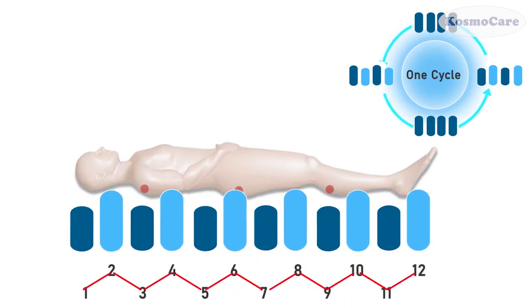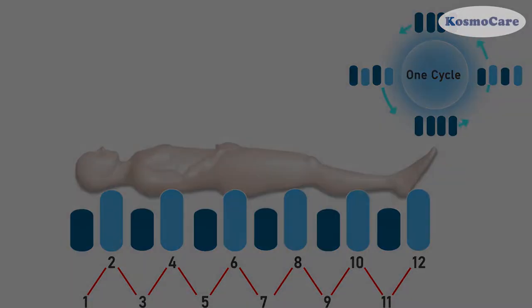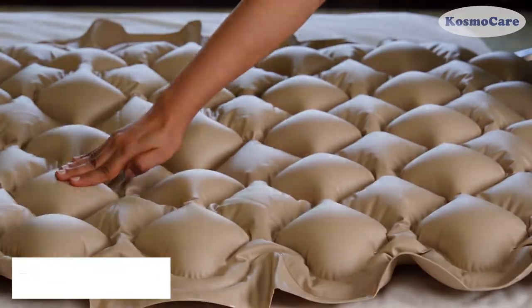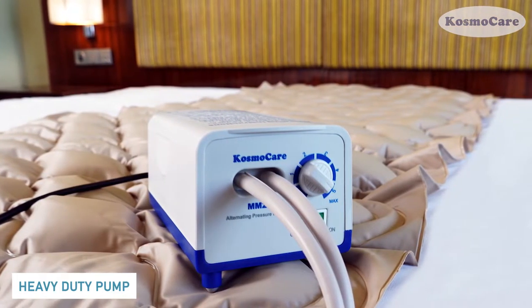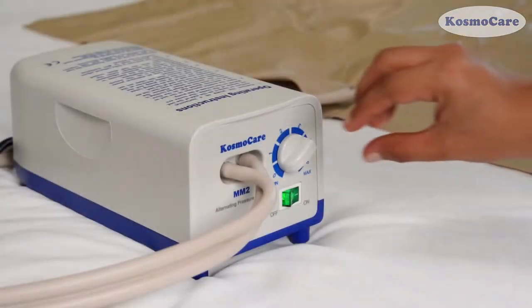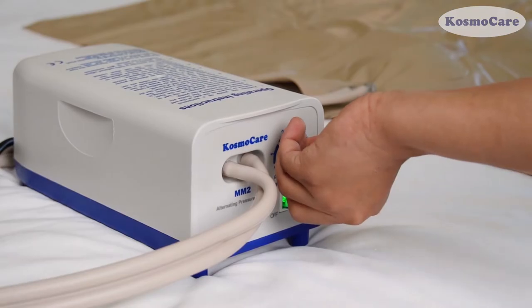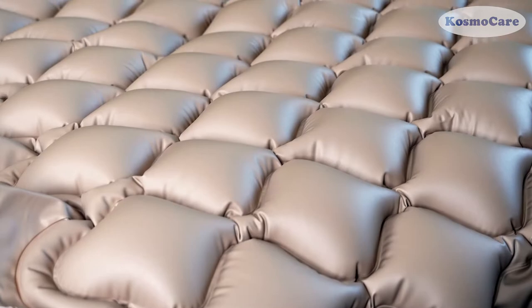Each of the 130 air cell bubbles inflate or deflate to evenly distribute the user's weight, thereby eliminating pressure sores. The MM2 model offers a heavy-duty air pump that is durable and long-lasting. The pump offers multiple levels of pressure for customized comfort, and is ultra-quiet for restful and undisturbed sleep.